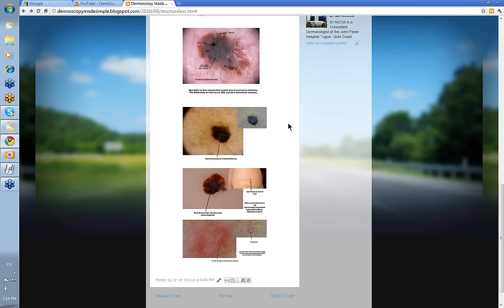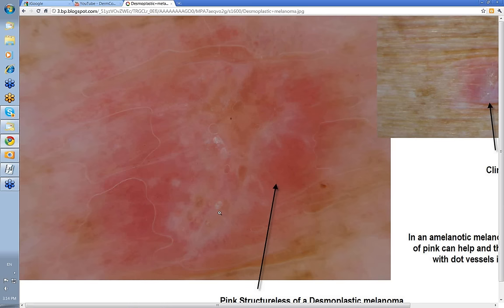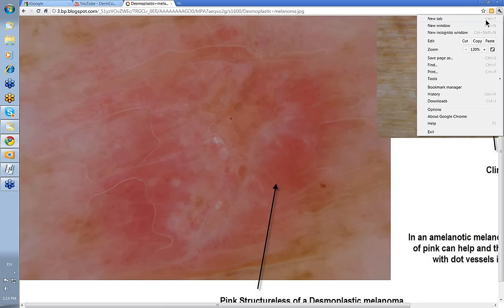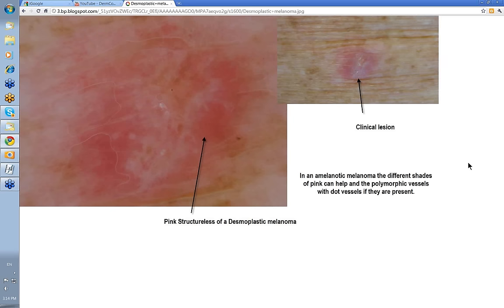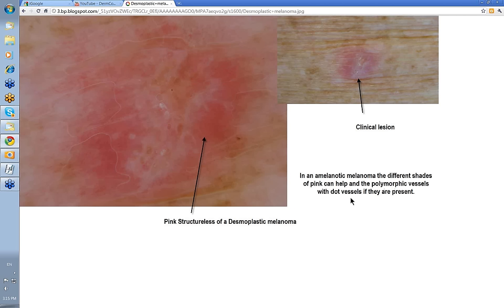A wide lot of differentials in the Structureless element. The last one I wanted to talk about was pink Structureless. Pink Structureless may be a feature of an amelanotic melanoma. Usually if you look in the allegedly Structureless area, you'll see some blood vessels — polymorphic blood vessels with dot vessels — then it's likely a melanoma, an amelanotic one. This in fact was a desmoplastic melanoma. Scott Menzies regards different shades of pink as a good marker for melanoma, but I always like seeing polymorphic vessels with dot vessels to help make that clinical diagnosis.